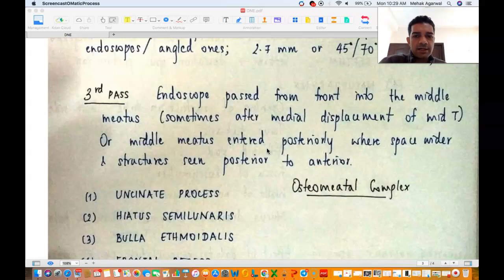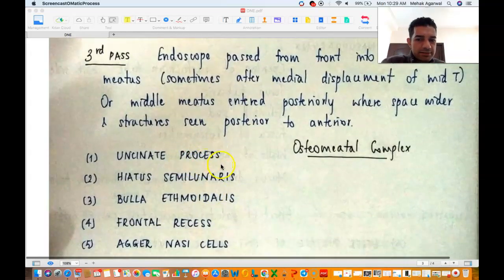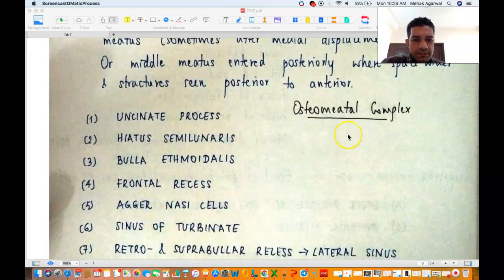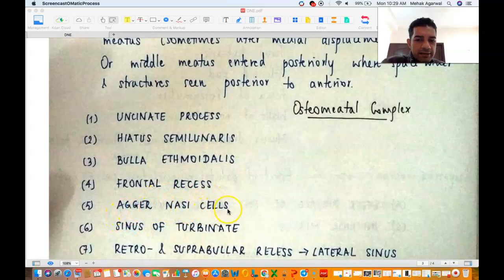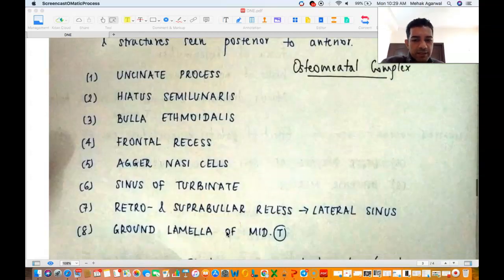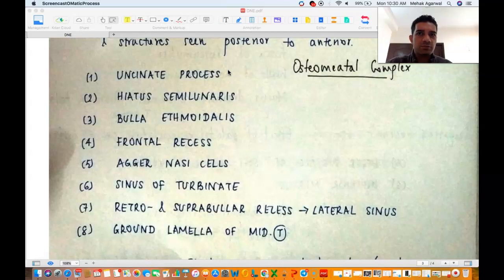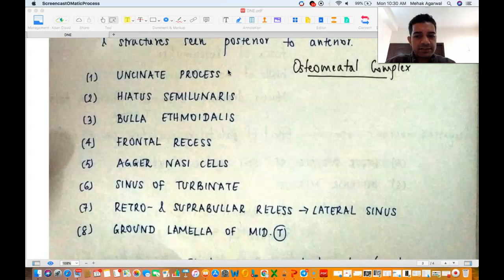Either way you enter the middle meatus, and now what do you see? The most important structure is the osteomeatal complex (OMC), very important for sinonasal drainage. The OMC comprises the uncinate process, the hiatus semilunaris, the bulla ethmoidalis, and the ethmoidal infundibulum (appreciated through the hiatus semilunaris). You also see the frontal recess, agger nasi cells, turbinate sinus, supra- or retrobullar recess (called the lateral sinus), and the ground lamella or middle one-third of the middle turbinate.